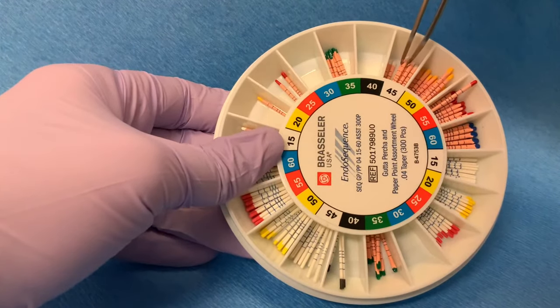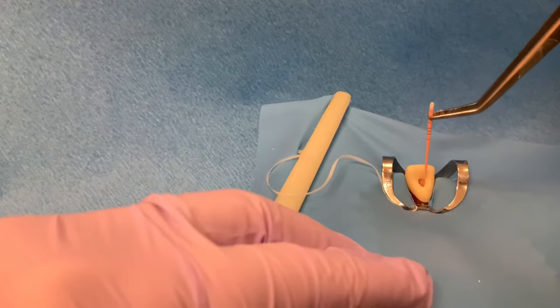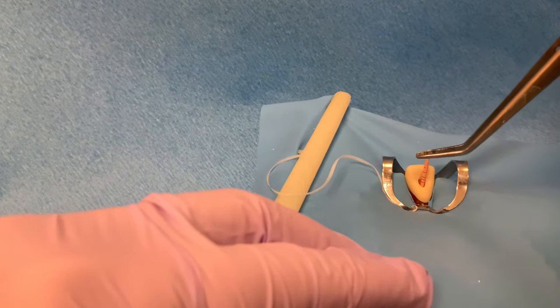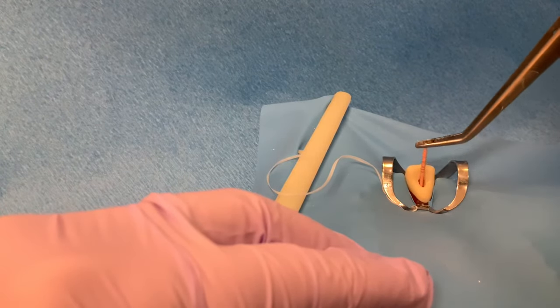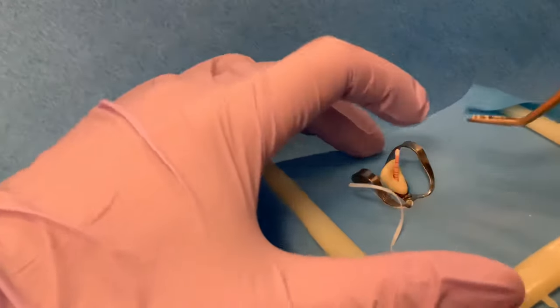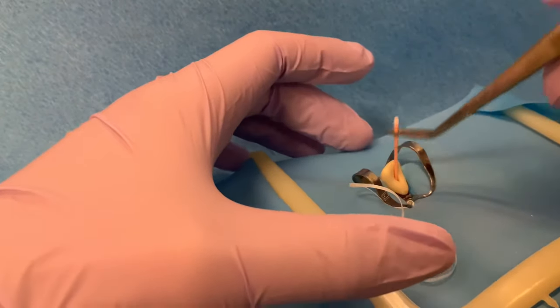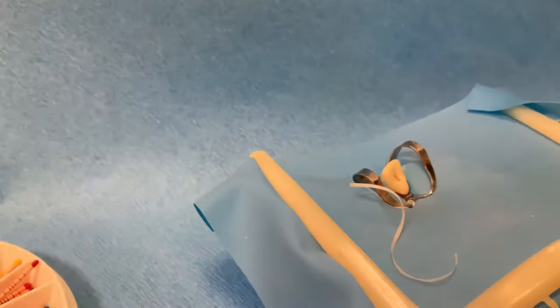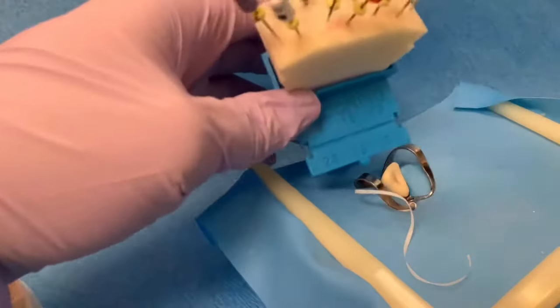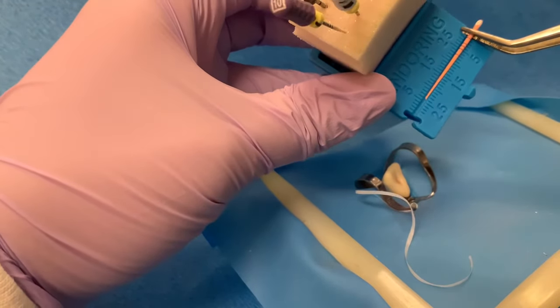Since the size 40 gutta percha seems too loose, we will try the size 45 next. When this cone is placed, it has slight tug back, but it seems to be short of the working length. Taking this cone to the ruler shows that it is short of the working length by 1 mm.